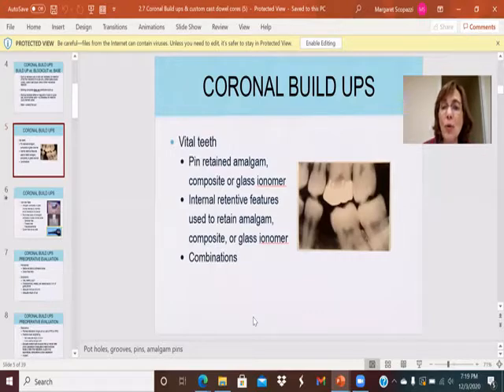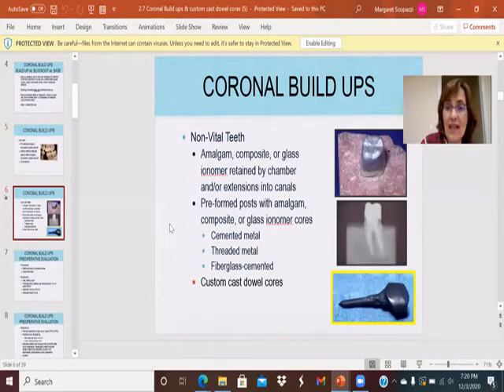A coronal buildup with pins — these are the pins going down. This one looks like it is in the pulp, but as we know, an x-ray is a flat representation of a three-dimensional object, so hopefully this pin is more on the palatal side.